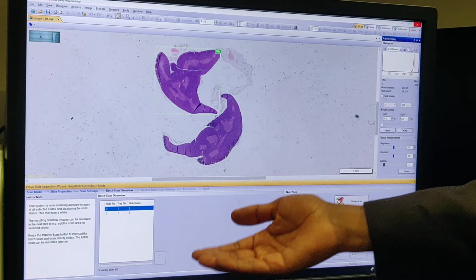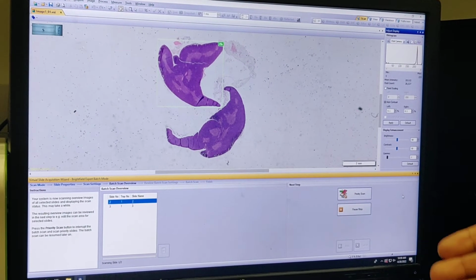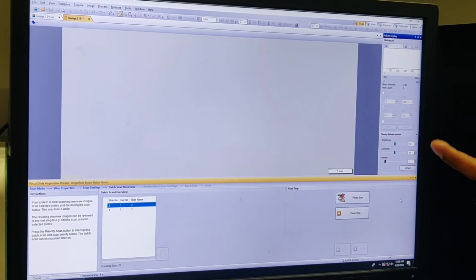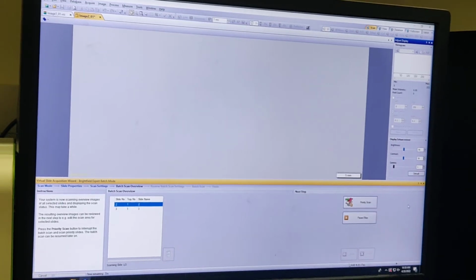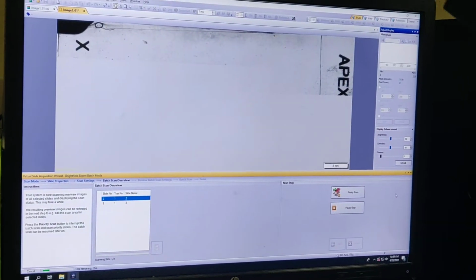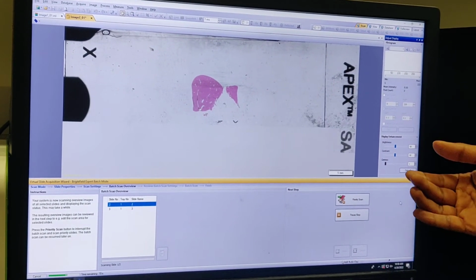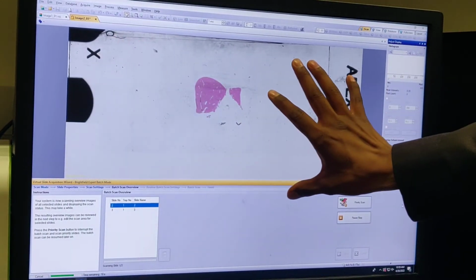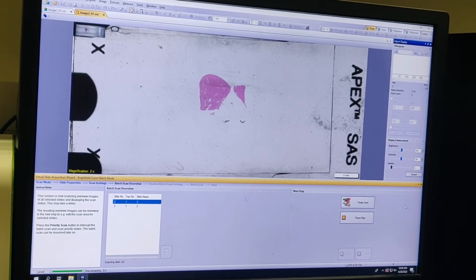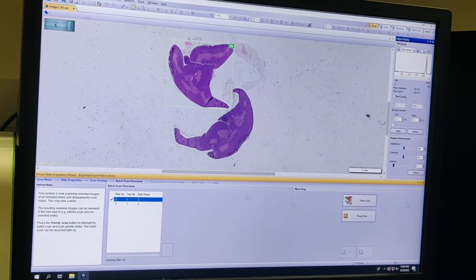And then it will scan, say suppose each slide is taking 3 minutes, so 50 multiplied by 3 is about 2.5 hours. So that means it's a nice nap time, and your images will be acquired and automatically saved in the location of choice, whatever storage location you specified. It will not keep the images open like this. Why? Because it knows that you are not sitting here. So if the images are not there after the scan, don't worry, it's stored in the location.